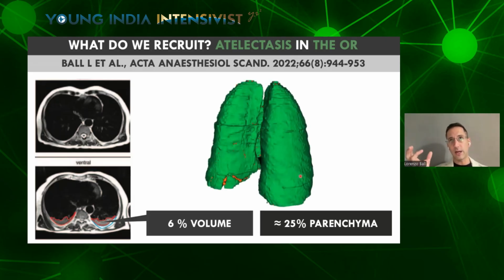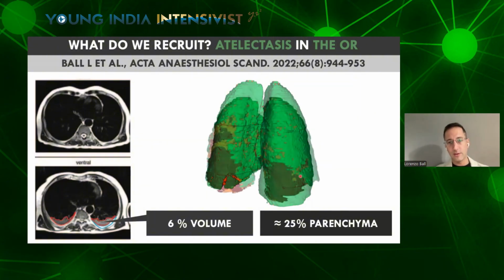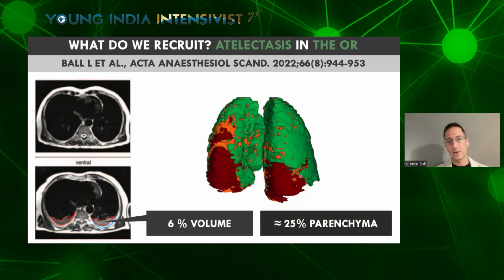If we do a 3D reconstruction of the lungs, we see this is preoperatively, so nearly all the lung is ventilated or aerated correctly. If we induce the general anesthesia and mechanical ventilation, this is the scan of the same patient. You see that the lungs become much smaller, especially on the craniocaudal diameter due to the upward displacement of the diaphragm. And areas of the dorsal lungs start to collapse, and these are these red areas which represent atelectasis in our surgical patients.